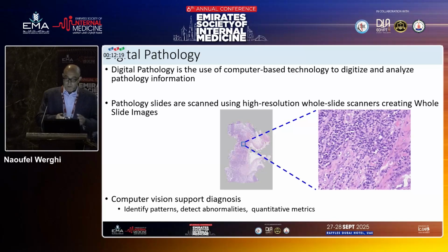Now, let's go to our application. It's digital pathology. Maybe some of the audience are more familiar with that. As you know, when pathologists want to analyze something in the patient, they take a biopsy, put this under a microscope, get different magnifications, and then they look at the cells, at the landscape, and then they come out with a given analysis or diagnosis.